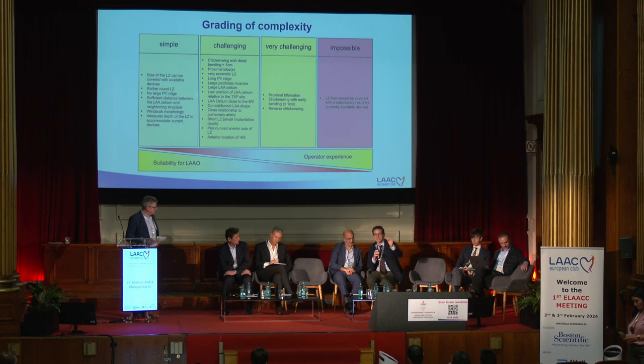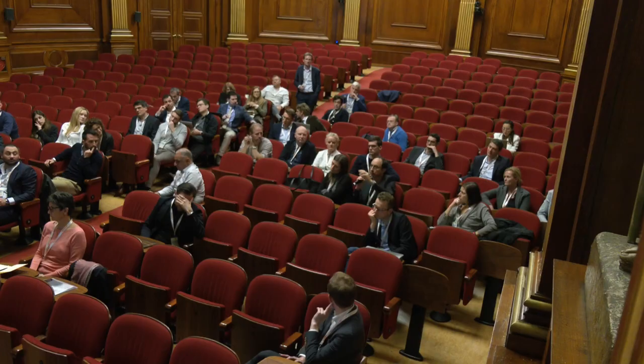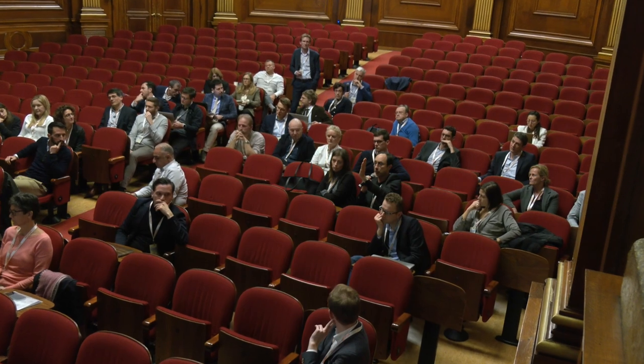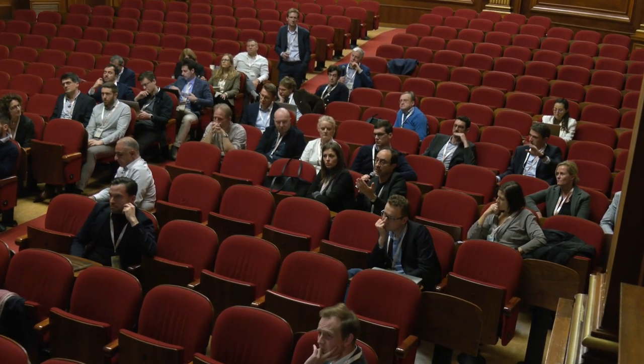So which criteria derived from the CT that have to do with the axis would you mention that are not written here? Because otherwise it's not accessible. I mean, we all agree that if you find yourself with a challenging axis, it's challenging, but you cannot predict it. Maybe you could. You could have a direction from the fossa to the ostium, then know if there is an angle, and quantify this angle.